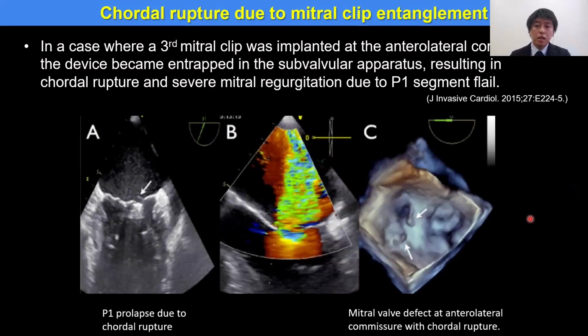However, in such non-central implantation, the mitral clip can be entangled by the chordae, which can lead to chordal rupture. At least, such lateral non-central implantation requires a careful procedure with consideration to reach the chordae network beneath the valve, which cannot be readily observed with clinical imaging.